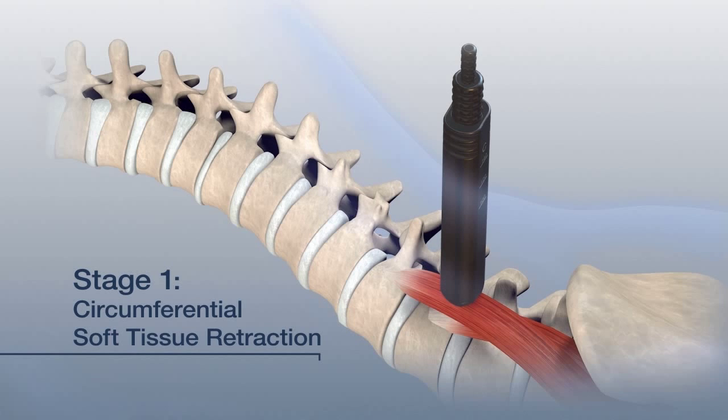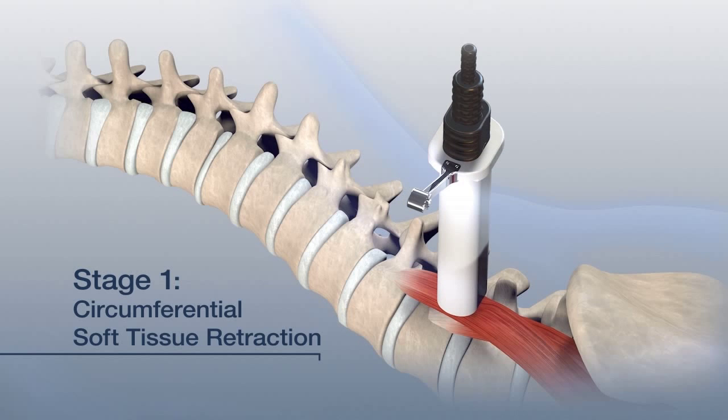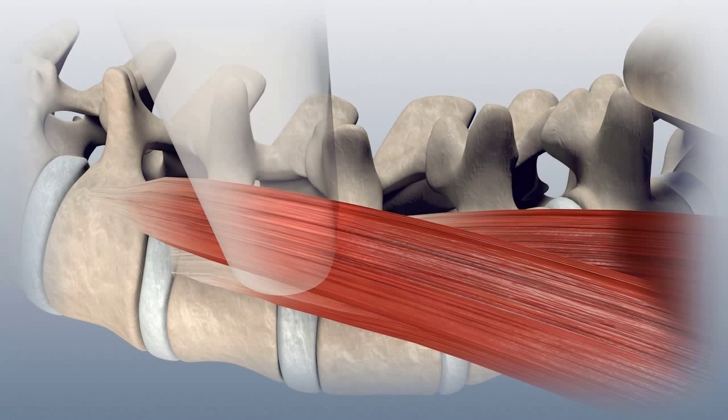Select the appropriate length tubular retractor and advance it over dilator C to the psoas. Secure it to the table-mounted retractor arm. Remove the dilators and insert the stadium mount light. Confirm retractor placement with fluoroscopy.